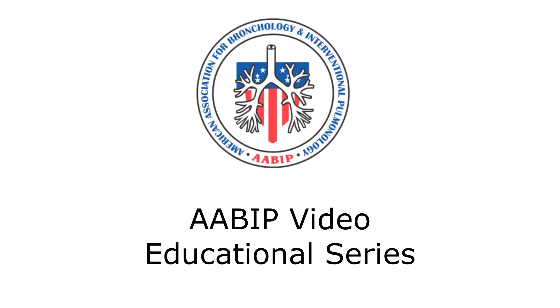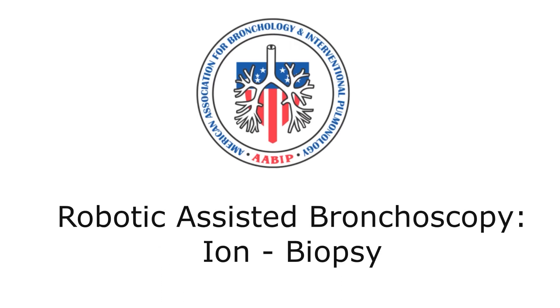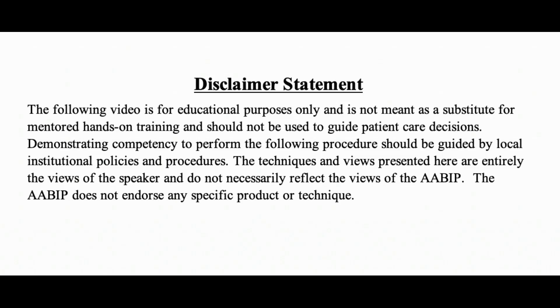AABIP Video Educational Series: Robotic Assisted Bronchoscopy, ION, Biopsy.